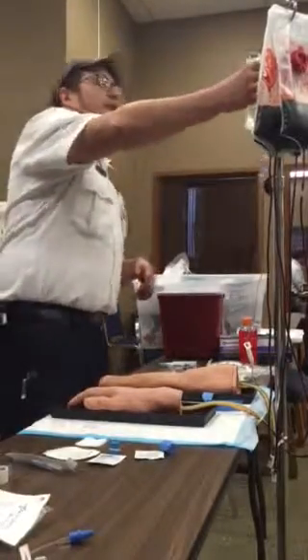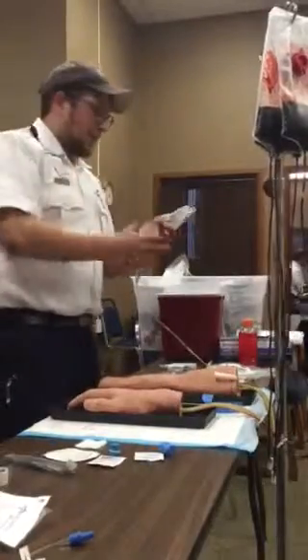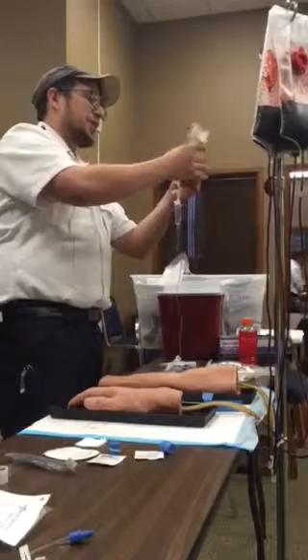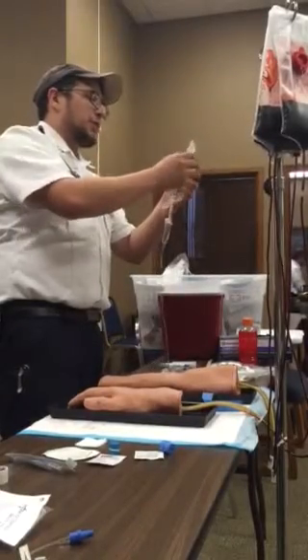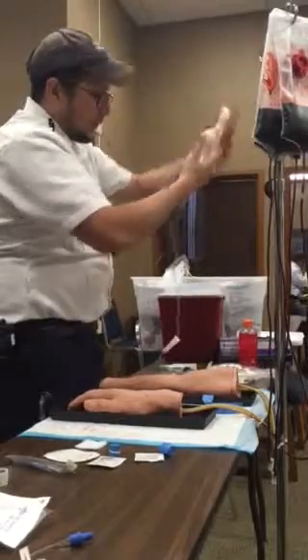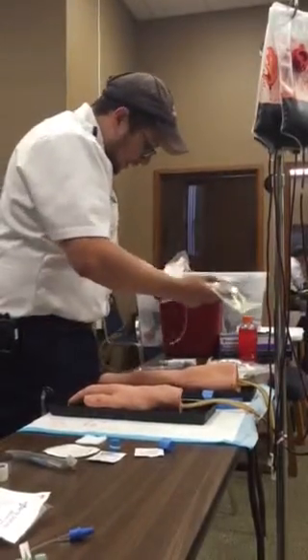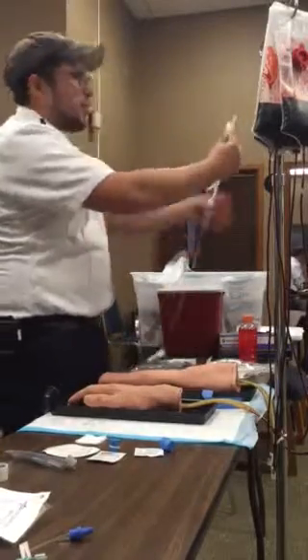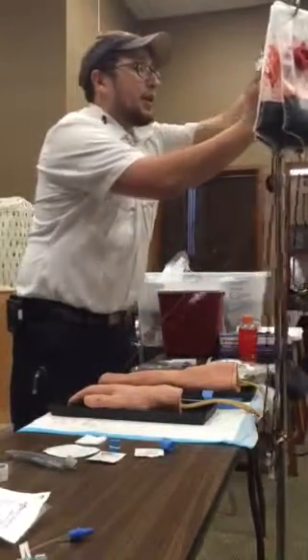Scene is safe. I'm going to go ahead and look at my saline solution here. I'm going to make sure it's clear, no particulates floating around, and make sure it's not expired. Alright, looks good there. I'm going to grab an appropriate size administration set, spike my IV bag, fill my drip chamber up halfway, and hang my line here.